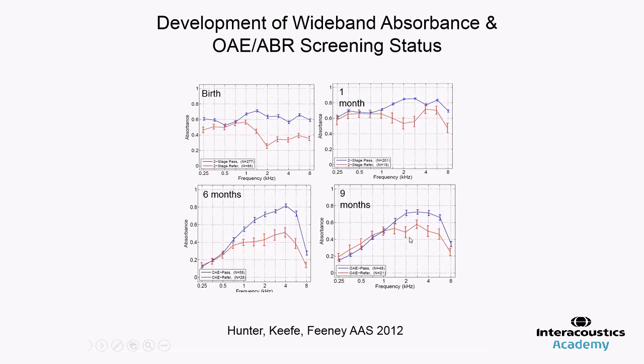So this is the first study that has tracked the same infants over time. And so we really feel confident that over the first year, and combined with the earlier studies that Doug Keefe did, this is a tool that can be used across a wide age range with good sensitivity.